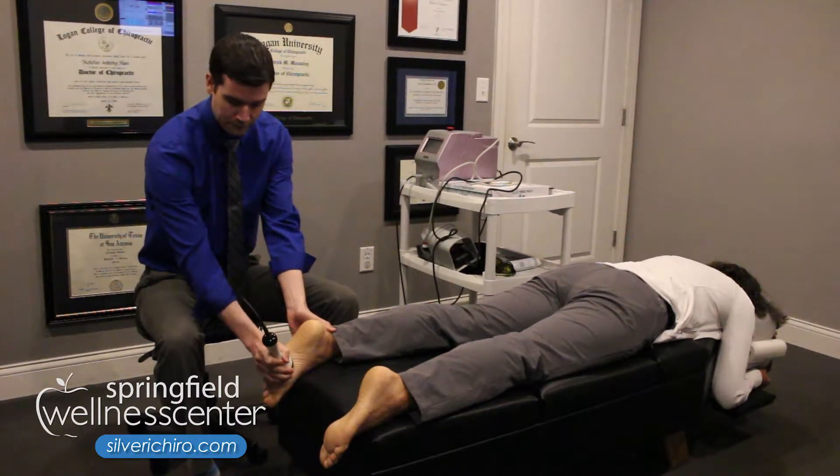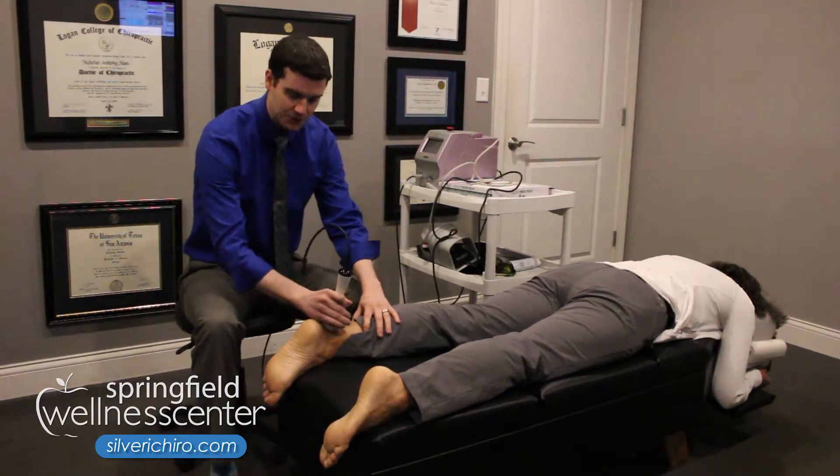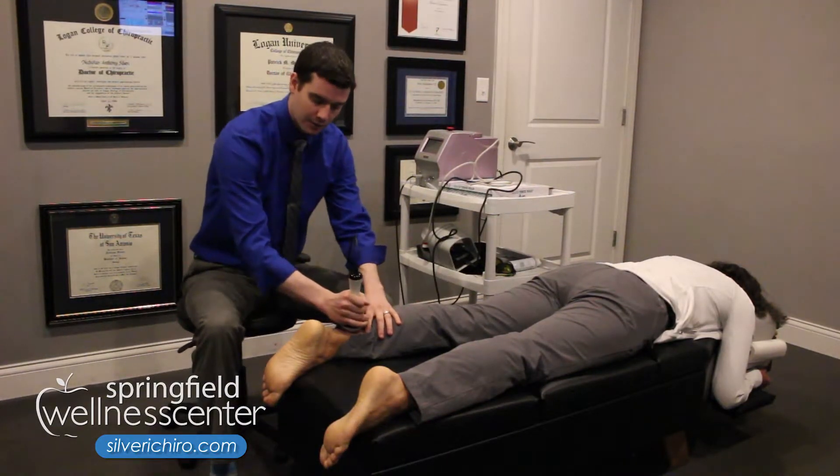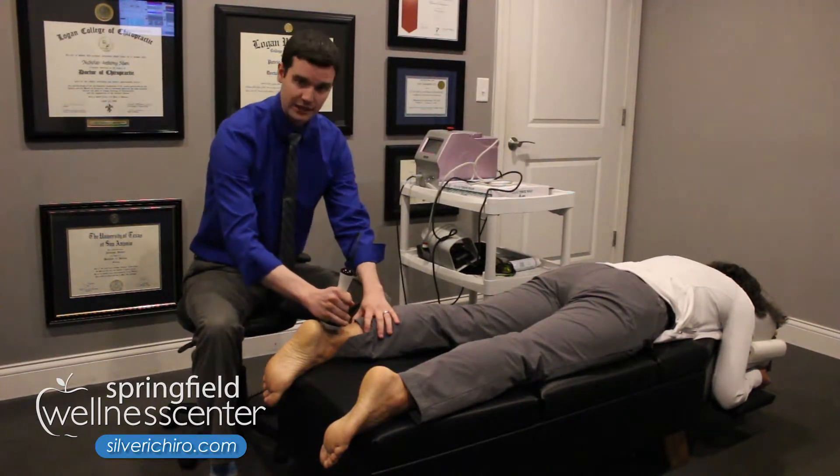We'll do that for a few minutes for a treatment. We'll also come up here into the Achilles region as well, because that tissue wraps around the heel here. And we'll expose that tissue as well to the laser light.